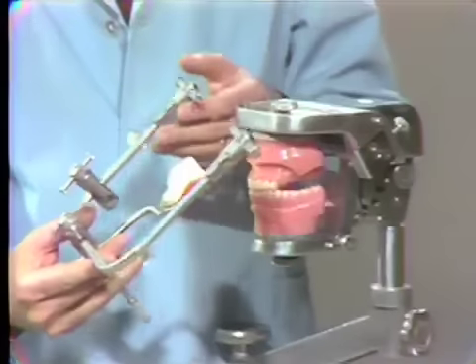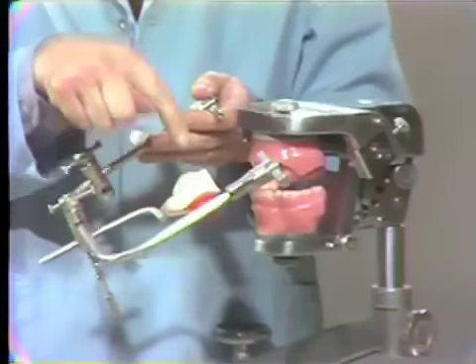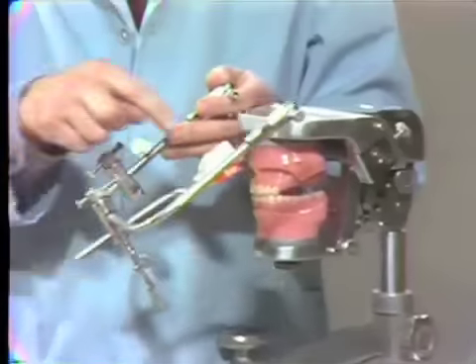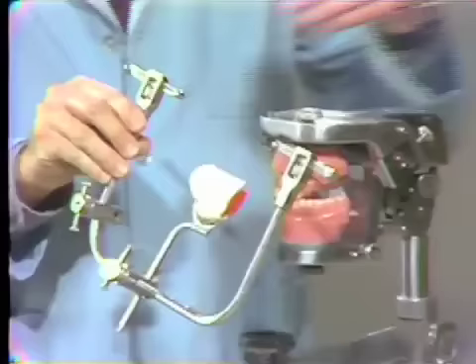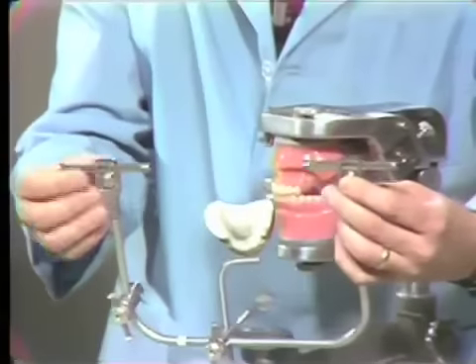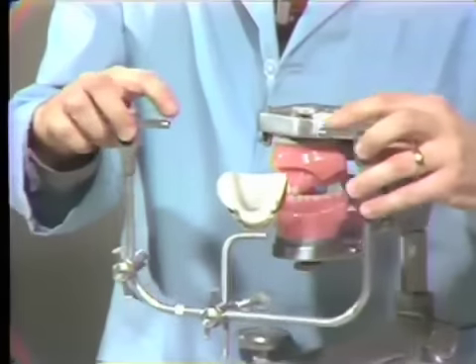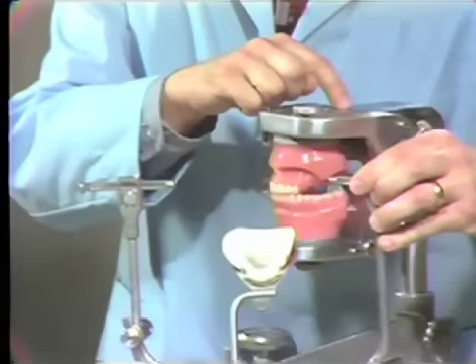When you mount the upper cast, don't put too much force on the face bow which would swing it around. If it swings around, we have to go back to the mannequin and make a new registration. The mechanisms in the condylar area are fixed and tightened, so don't loosen these. This intercondylar distance fits the Hanau articulator and not the mannequin.